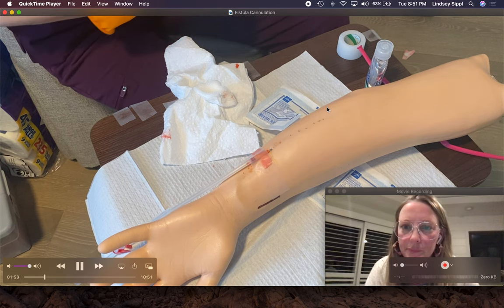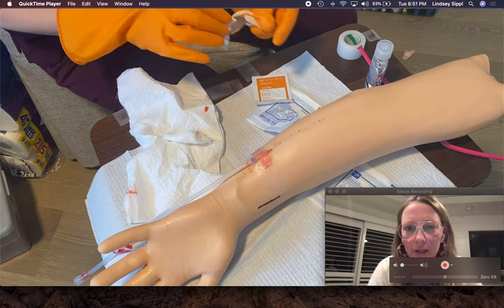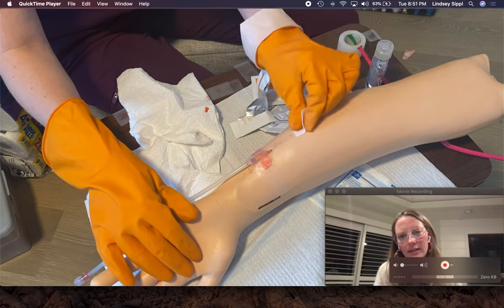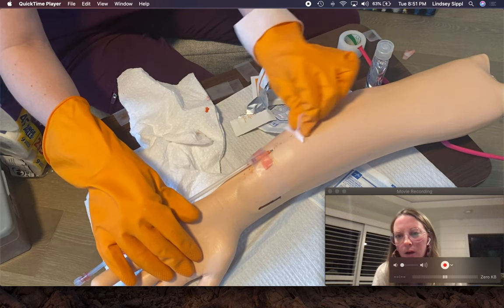That pulsing blood return — that's what you want. I'm going to clean the venous site again. Good job. One-minute scrub, quick dry for alcohol.